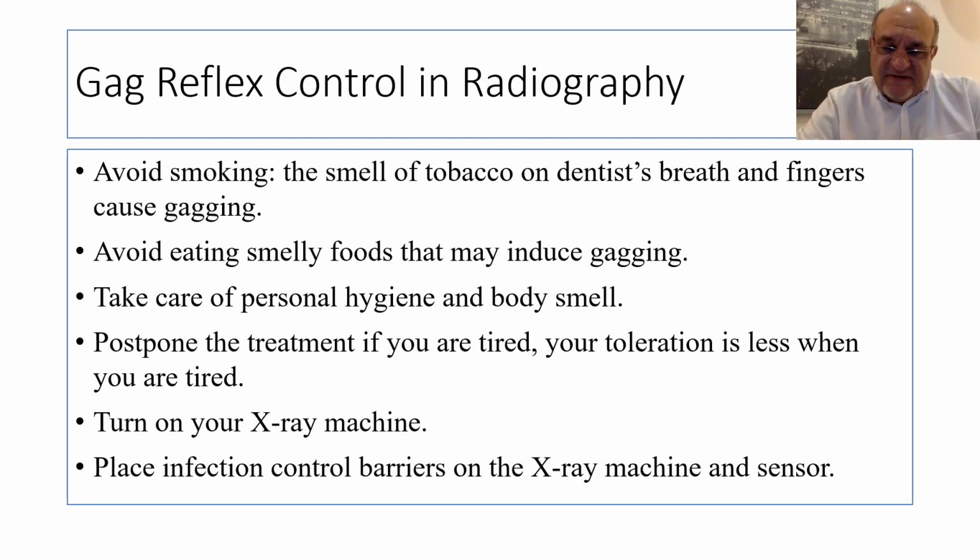both of them may initiate the gagging reflex. There are certain points which, from my readings, I didn't find mentioned, and I would like to mention them now.